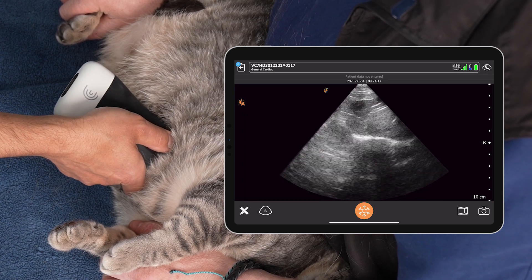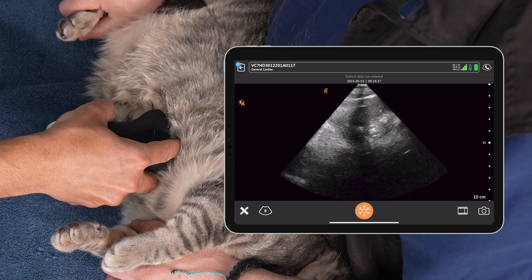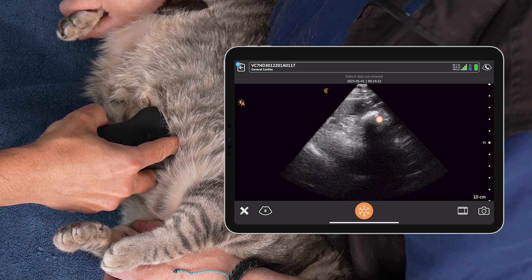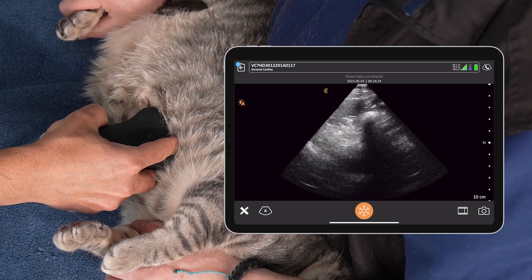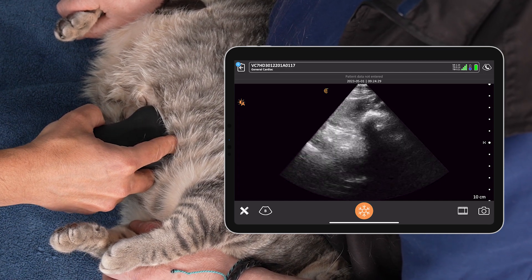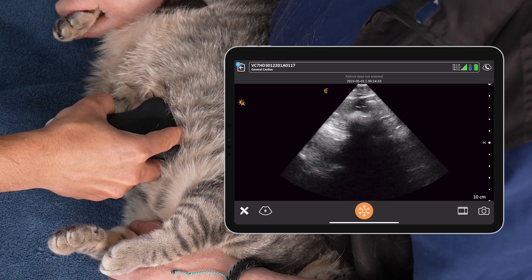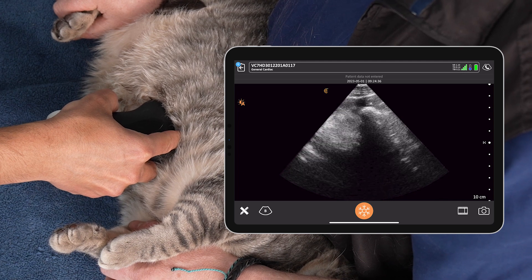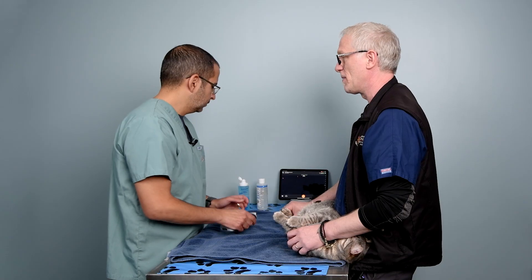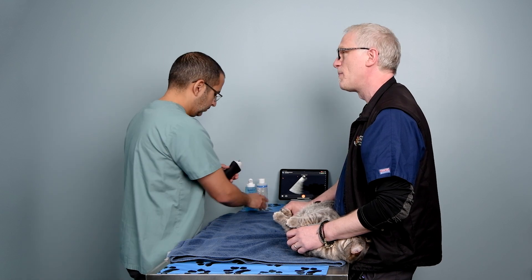The last thing we want to look at is the stomach. We can unrock the probe so we're more perpendicular — there's the stomach right there. We can see nice big gas shadows in there and we can watch it to see if it contracts. Normal contraction in the stomach is well-determined in dogs — about three to five contractions per minute — but the research is lacking in our feline patients. Alright, so that was long axis, and then we want to flip into short axis and repeat those same questions.